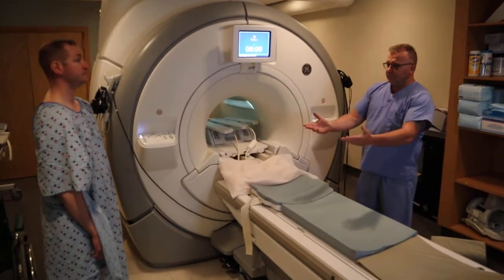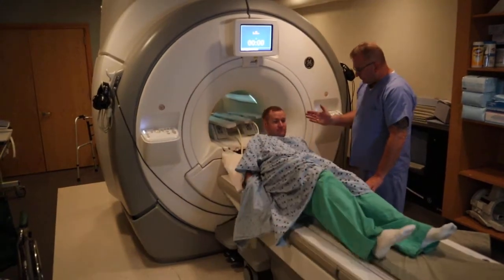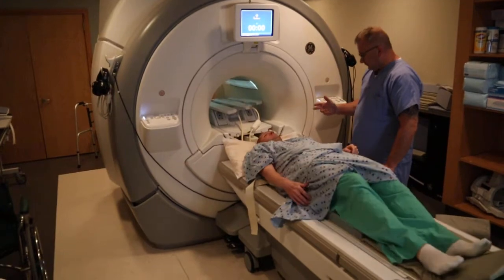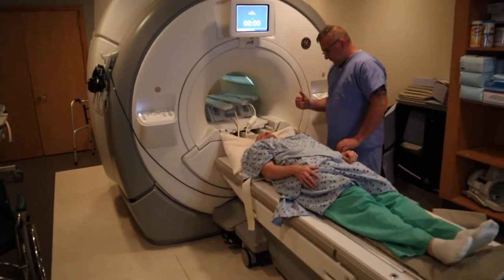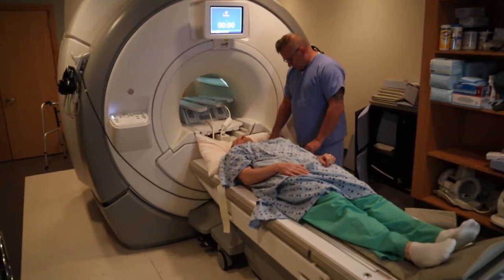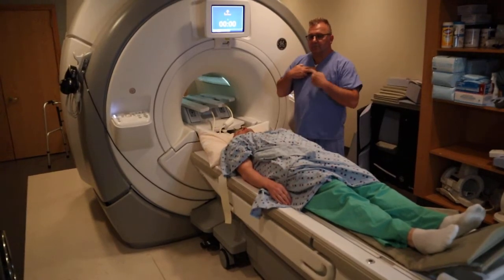We're now going to position for an MRI brachial plexus. The patient's going to be laying supine, head first, flat on their back. We're going to be using the 8-channel cardiac coil, which allows for parallel imaging. You want to position about two fingers above the sternal notch.